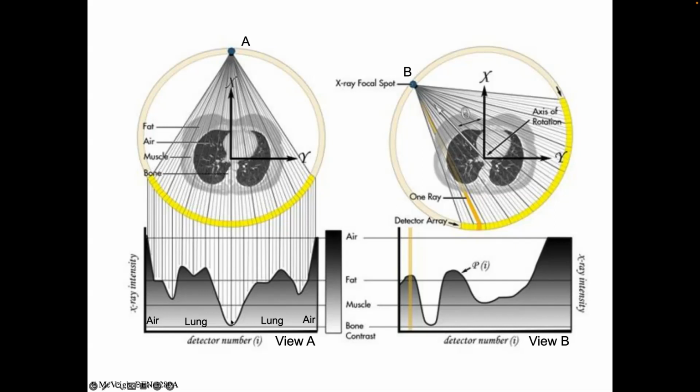And I know that I'm not seeing many X-rays. Right, so most of the X-rays have been absorbed along this line. The reason is there's the patient's sternum here, which is a big bone right in your chest. There's the aorta, which might have some contrast in it, and then there's the spine, and the spine will absorb a ton of X-rays, right? And so it casts a very deep shadow, right? We don't see many X-rays there.